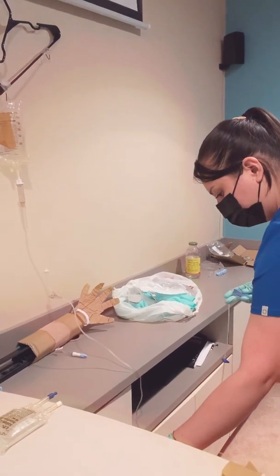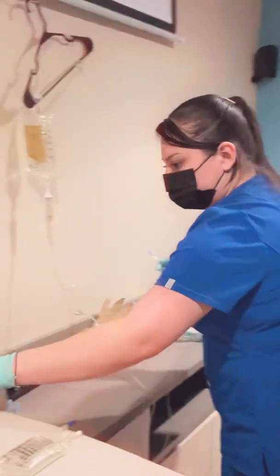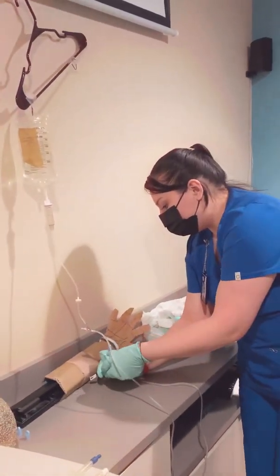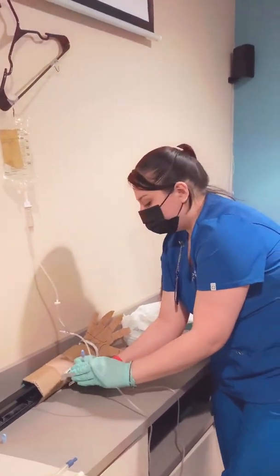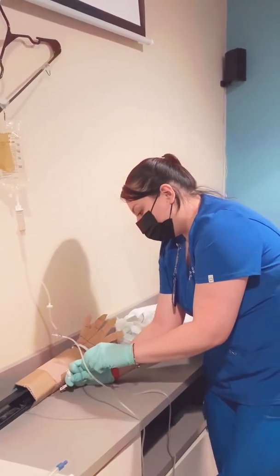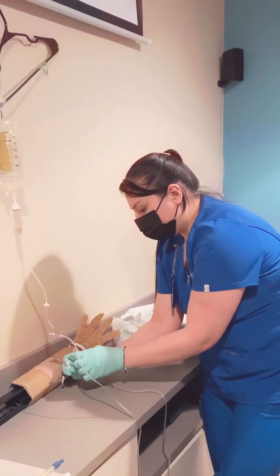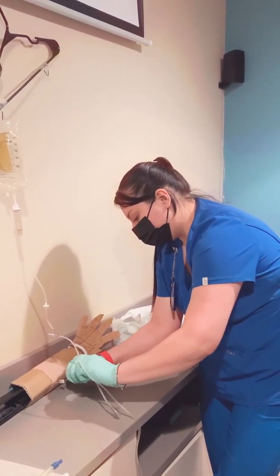Okay. And then I'm going to come to the IV site and I'm going to remove this cap here. Swab for 30 seconds. Remove the cap and attach using sterile technique. Unclamp.